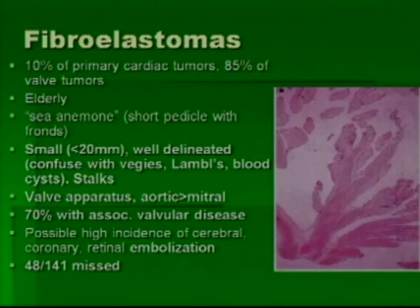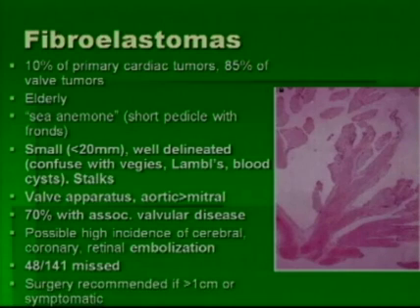One of the points to make, at least traditionally in one series, was that 48 out of 141 were actually missed. So it's easy to miss these, especially when they're quite small. As with a lot of tumors, if something grows larger than 1 centimeter, and of course if there are any symptoms, surgery is recommended.